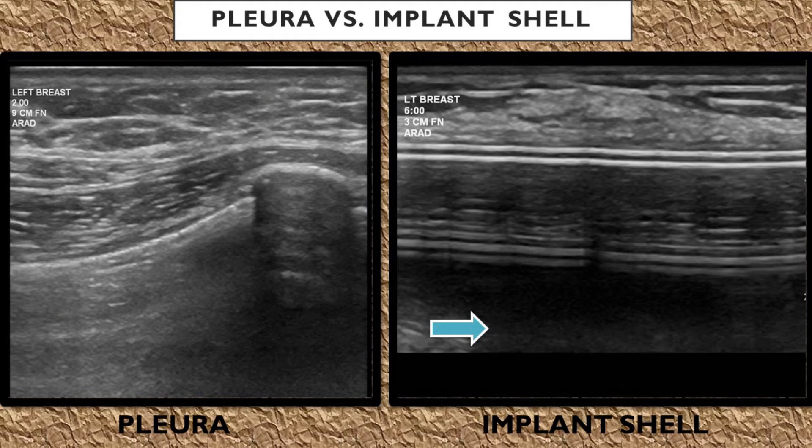When imaging an implant, it can have so many reverberation and other artifacts within the lumen that sometimes it can appear gray and hazy, like a lung.